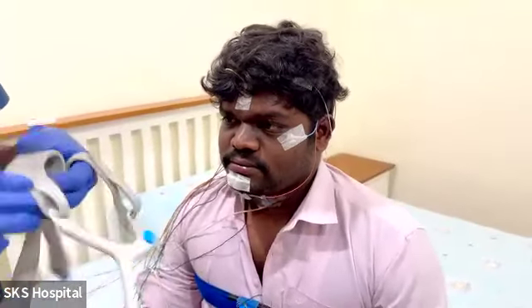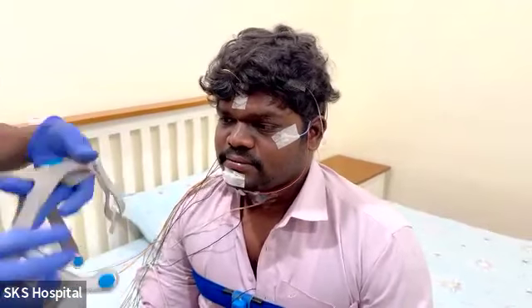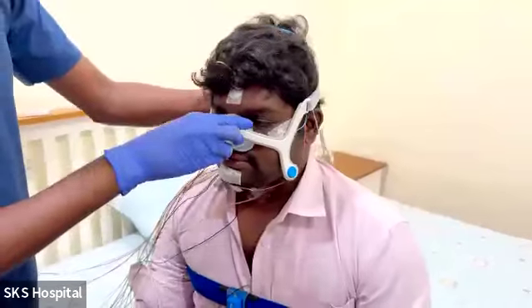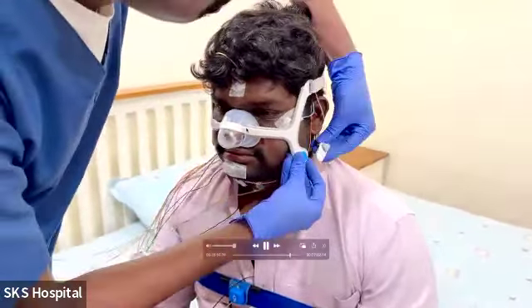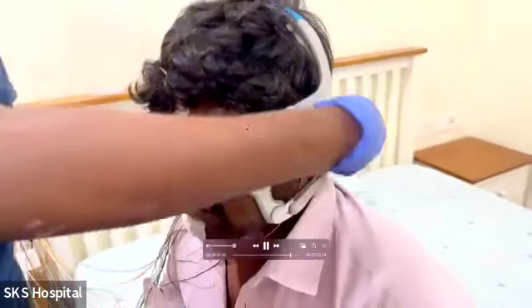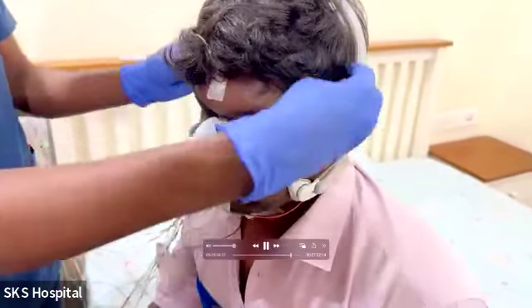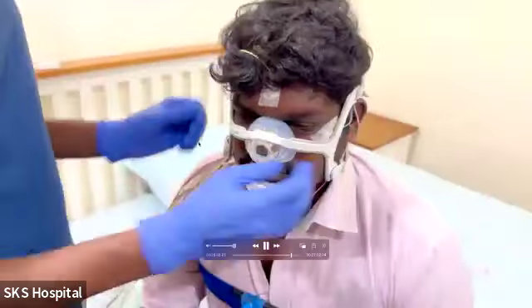This is just to show you how a mask is also fixed. So the nasal thermistor and the nasal cannula are taken off. Instead of that, a mask is being fixed to do an overnight in-lab titration. All the other leads will be similar to what we connect in a level 1 polysomnography, except the nasal thermistor and the nasal pressure transducer. The mask will be fixed, which senses the flow as well as the apneas and hypopneas.